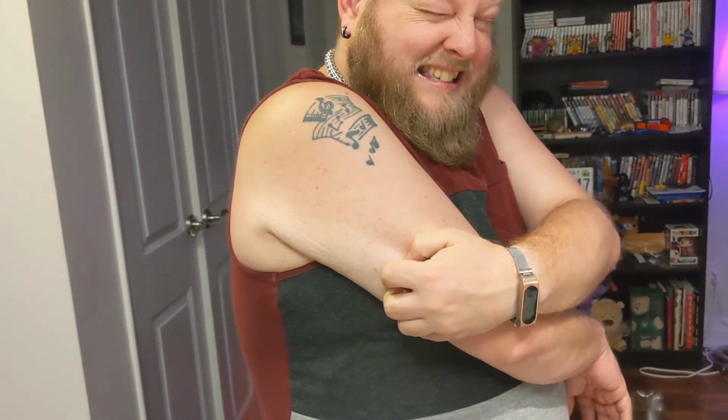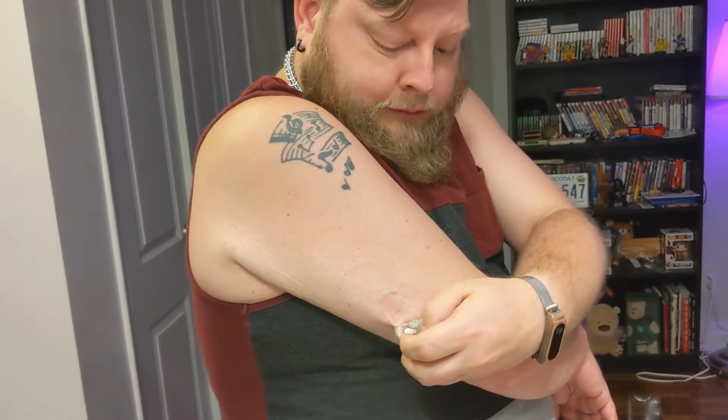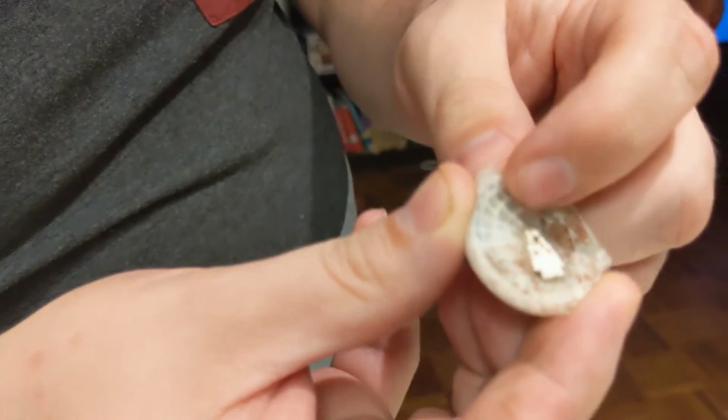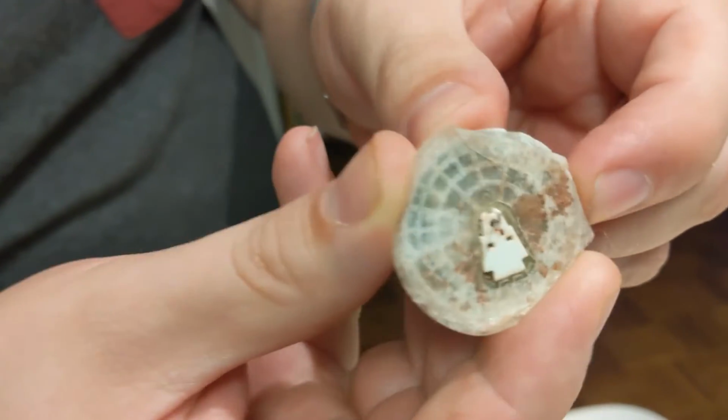Now, the old one, this might be a little sticky because we put the sticky stuff on, but you'll see in a minute. Oh, it's not too bad. And you can see this is what the back of the sensor looks like, and that's the little probe that goes inside of you that keeps track of your blood sugars. So you can have a needle for a split second, or a needle in you the entire time. Exactly. And really, it doesn't even really hurt all that much when it's being done.